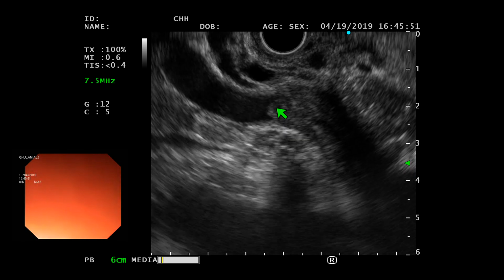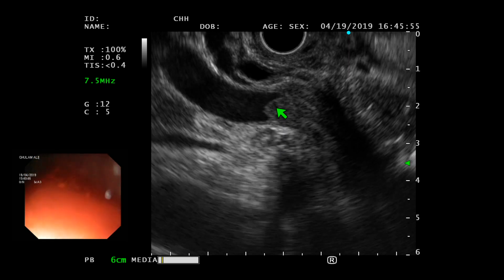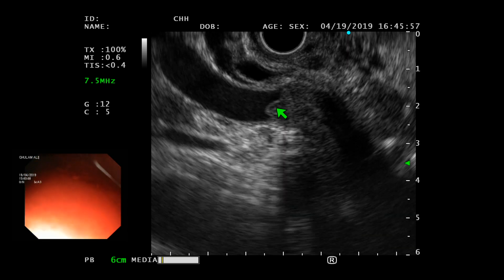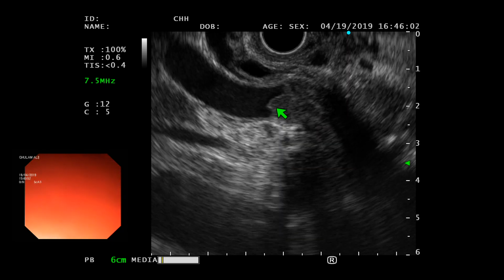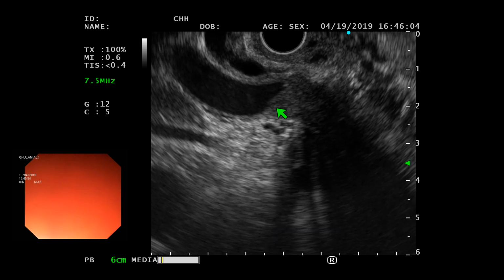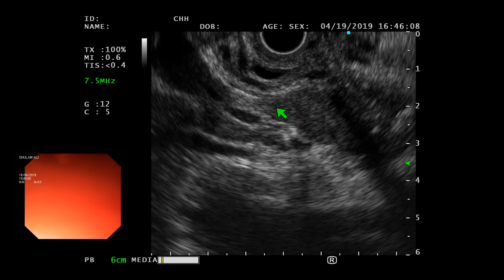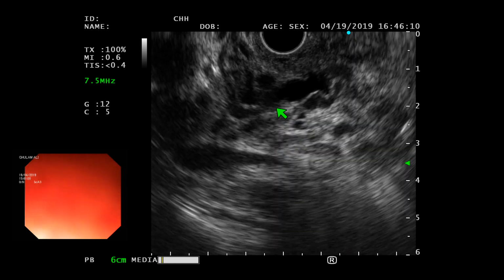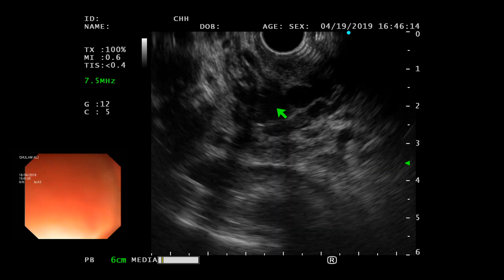Like these slides, somebody, if you are interested, take a look at those. There is a lot of necrosis you see, and then you see a group of viable cells which look like tumor cells, and then you see a lot of necrosis which also stains pink and pinkish bluish. So yes, collaterals. So I think there is a cancer on that, unfortunately.